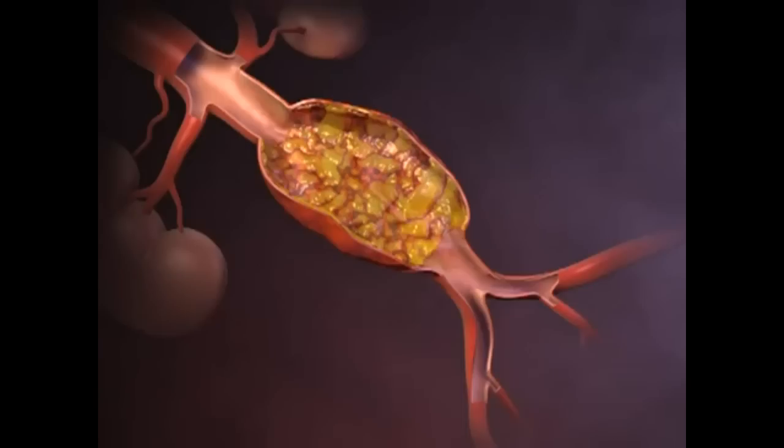In this procedure, a guide wire is introduced into the abdominal aorta through a femoral artery.